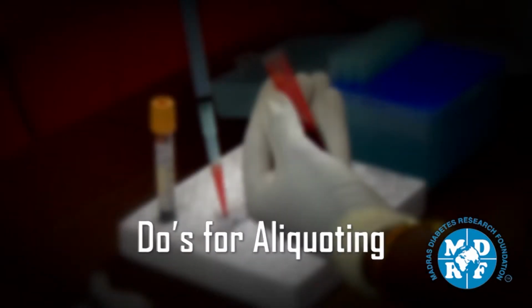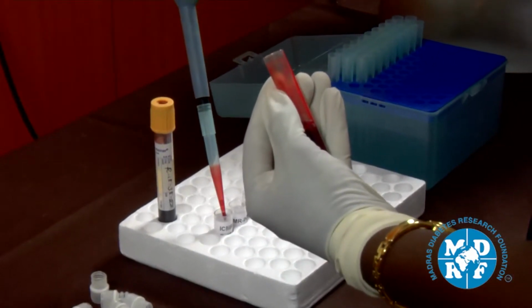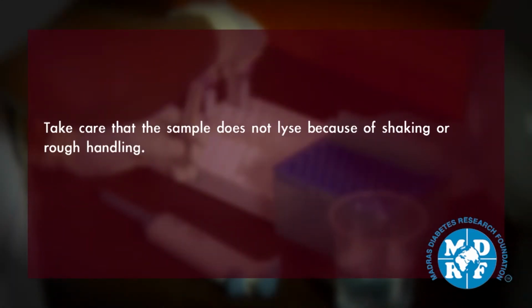Do's for aliquoting. Transfer the serum and whole blood from the vacutainer tubes into the respective cryo vials. Write clearly on the labels. Take care that the sample does not lyse because of shaking or rough handling.